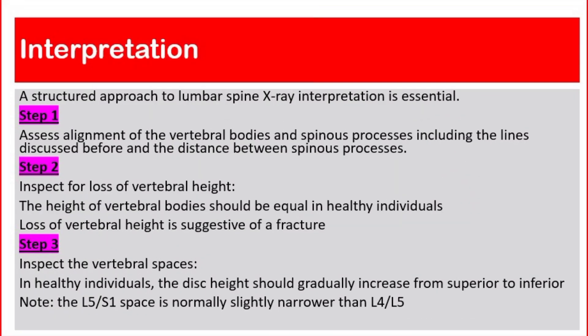Interpretation: A structured approach to lumbar spine x-ray interpretation is essential. Step 1: Assess alignment of the vertebral bodies and spinous processes, including the lines discussed before and the distance between spinous processes. Step 2: Inspect for loss of vertebral height. The height of the vertebral bodies should be equal in healthy individuals. Loss of vertebral height is suggestive of a fracture.